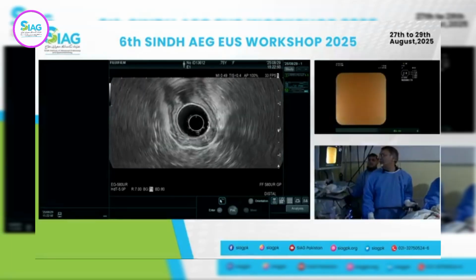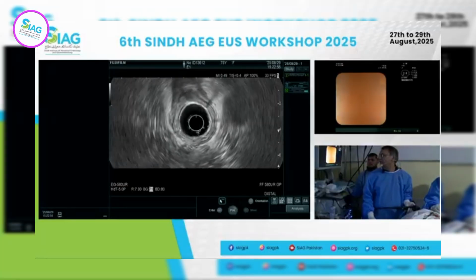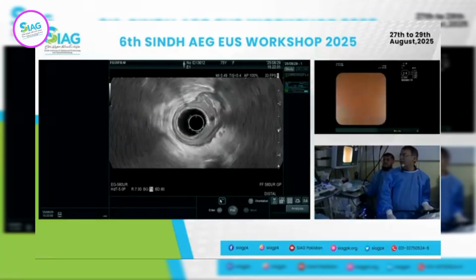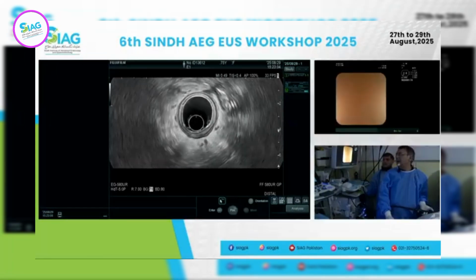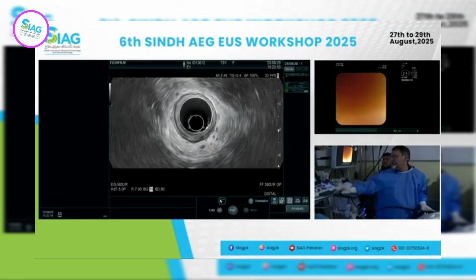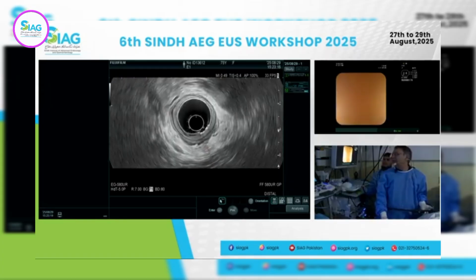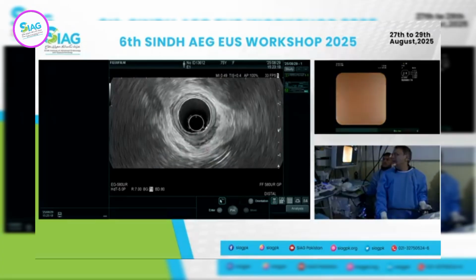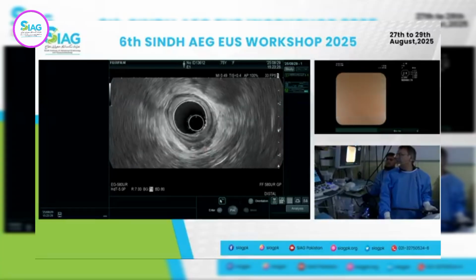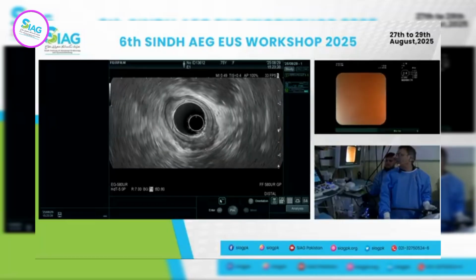Right here, you see a little bit of thickened wall itself. Khalid: G., just as you were moving, did you see any small lymph nodes at the 6 o'clock position? Let me try again. Yeah, there may be, and even if they are, they're not very significant. They look benign. There were small ones right there, one at the bottom, right here. Right there it is, but they look so small. And you see the wall thickening a little bit there, very nicely demonstrated. Thank you. I think it's just the inflammation there. You see that wall thickening nicely right there.